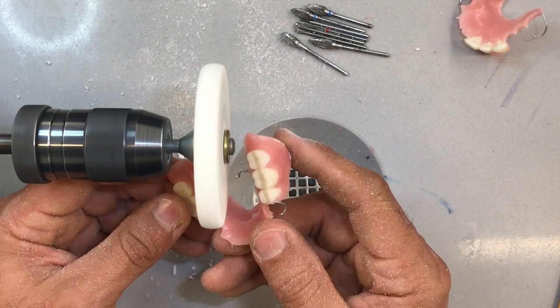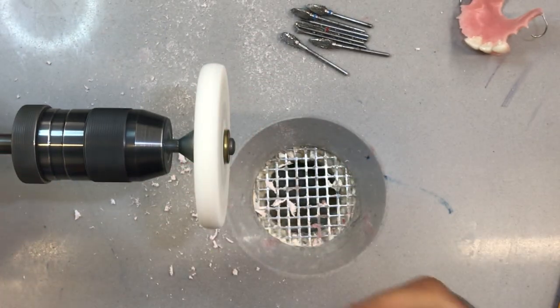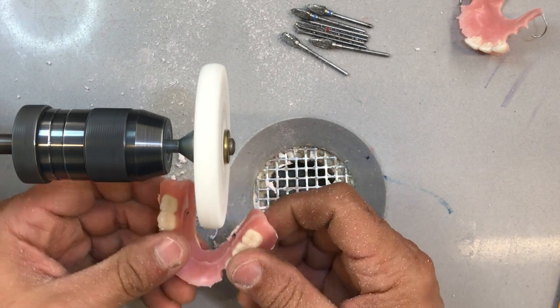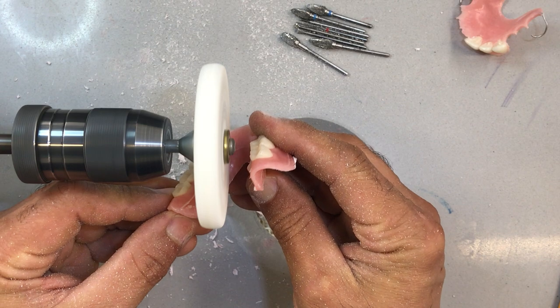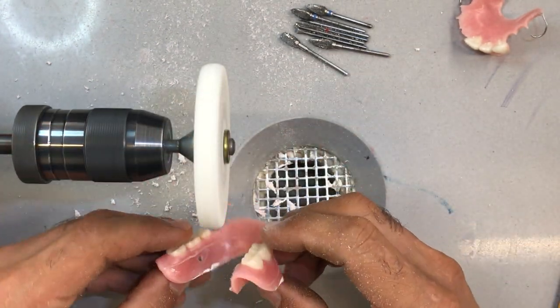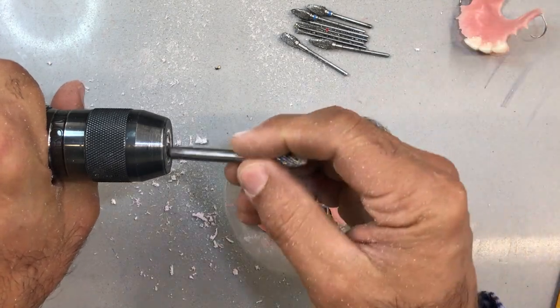I'm just using the edge of the wheel to kind of finish it. Same thing on the other side — you can be a little more aggressive up here, but as you get close, slow down a little bit so you don't burn the acrylic. I don't think I can do much more with this wheel, which means I can go into something smaller. I'm going to move into this tapered burr.